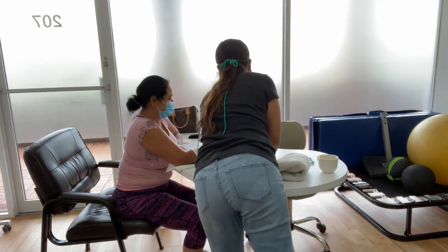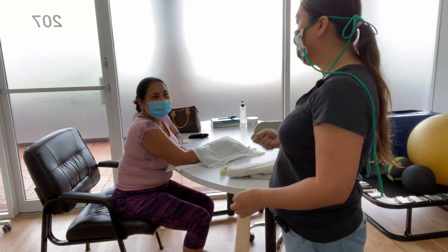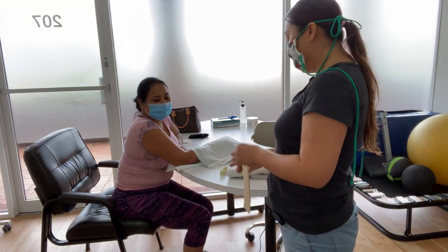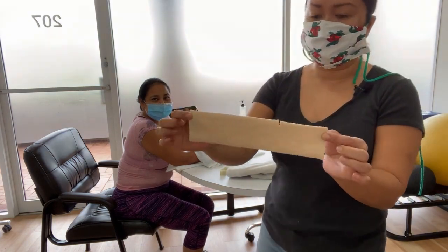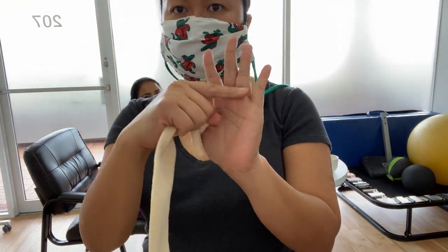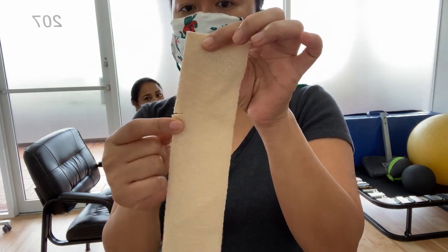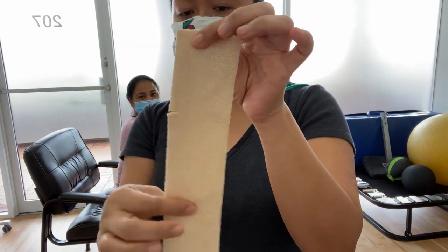I'm going to show you how to put this on — how I do it — and then you can tell your boyfriend how to help you. So when I cut a tippy grip stockinette to cover the end piece, because there's a trigger finger release, I want it to go a little bit higher. I'm going to cut the little thumb piece very low, because remember, everything stretches.